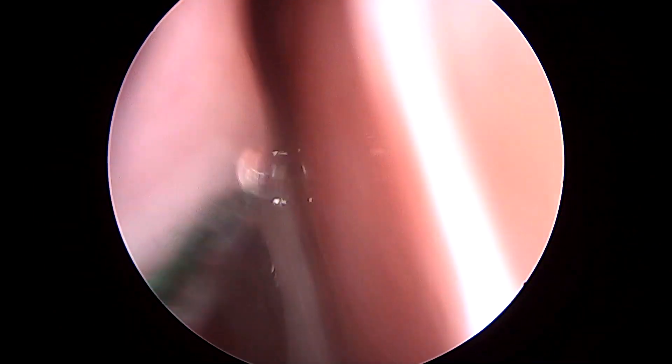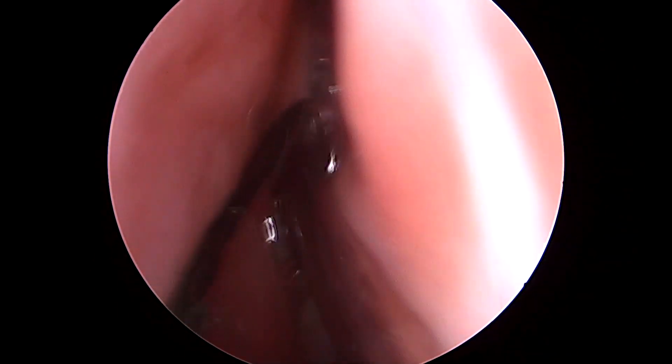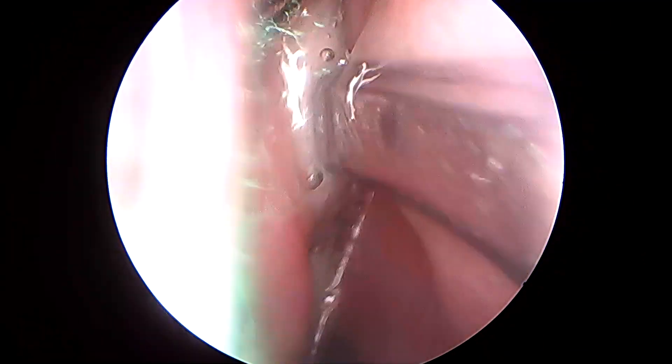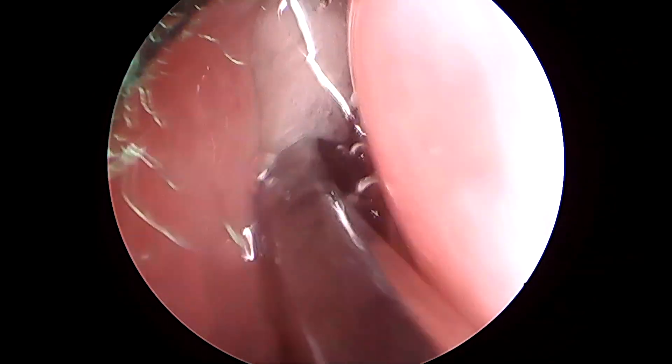You can see it's well settled between the nasal turbinate, middle turbinate, and the septum, putting pressure on the cribriform plate. I'm going to keep that inside for five minutes. Five minutes is more than enough for the decongestion and numbing to take place.